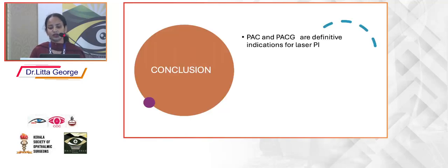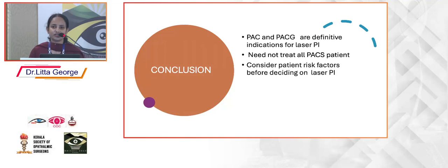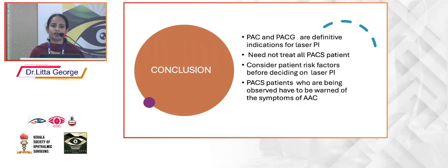So to conclude, PAC and PACG are definitive indications for laser iridotomy. You need not treat all PACS patients. Consider patient risk factors before deciding on laser PI in PACS patients. And whenever you decide to observe a PACS patient, please do warn of the symptoms of acute angle closure.